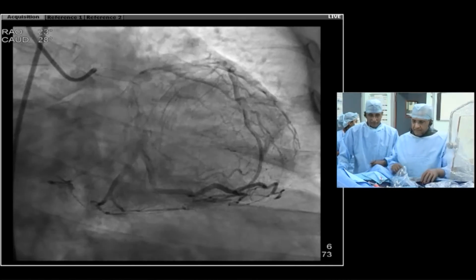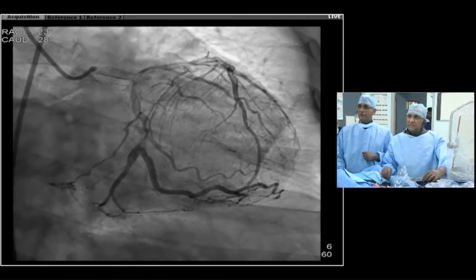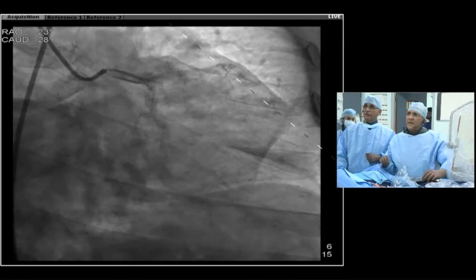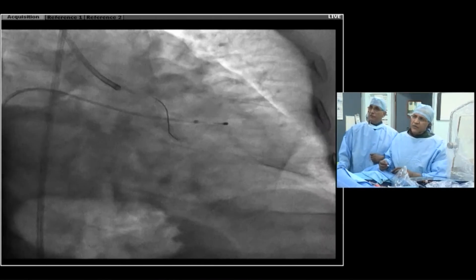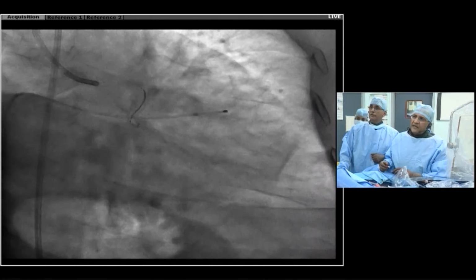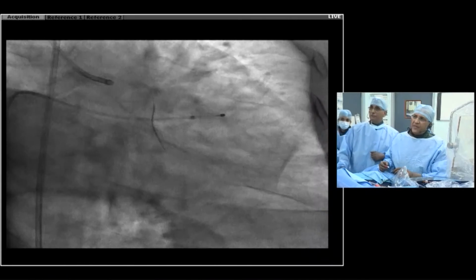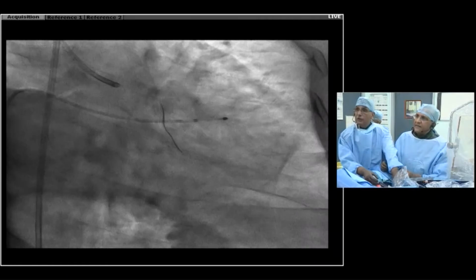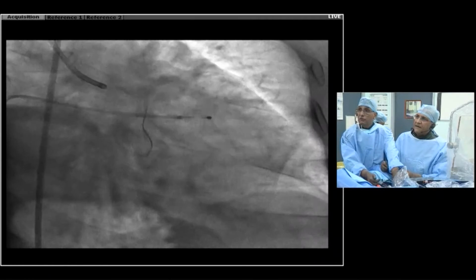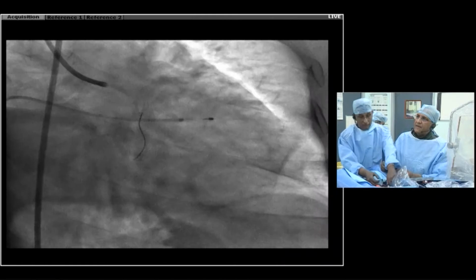And are you going to atherectomize through the distal left main, any other suggestions? Or are you going to dynaglide through the proximal circ? What's going to be your technique for that? I never dynaglide into an artery, I don't dynaglide antegradely into the artery at all. If at all, I will platform it just distally, platform it right at the left main and go and do what I think is right. Same for everybody here? Would anybody dynaglide forward or no? Yeah. No. Yeah, same here.